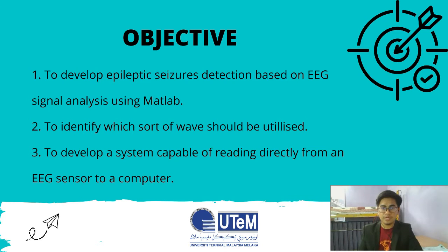So for this one, before this, they used Arduino to connect with the sensor. Then for me, I will try to develop a system that can directly connect from the EEG sensor, which is the brain sensor, to the computer.